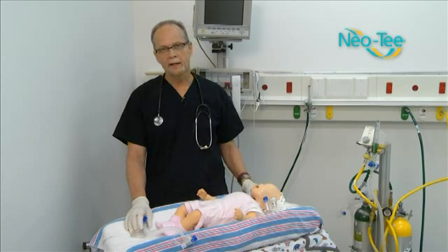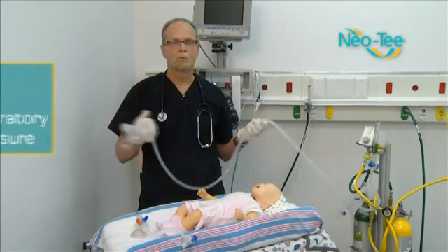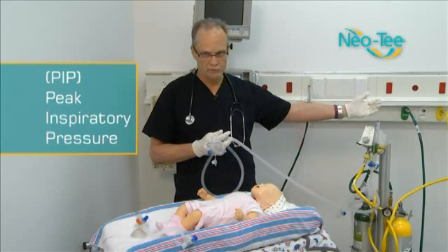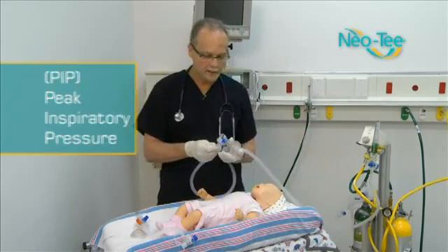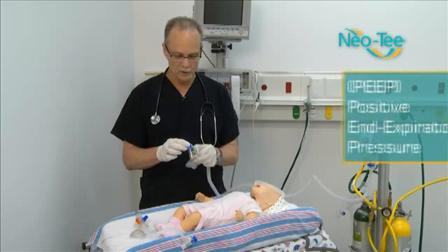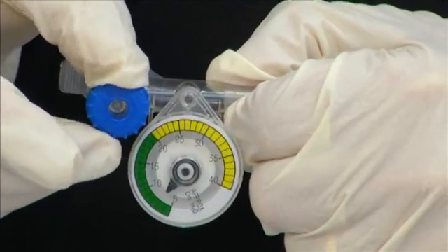We have two different types of NEO-Ts. The first one has a six-foot long corrugated tubing where the PIP controller actually hooks to the flow meter. The flow meter could be a fairly good distance from you, but that's where it hooks up. You have your corrugated tubing and your pressure manometer up at the mask, so the person doing the ventilating can see the pressure being used. We also have a PEEP on the end — your positive end expiratory pressure — which is the resistance the patient has to breathe against.